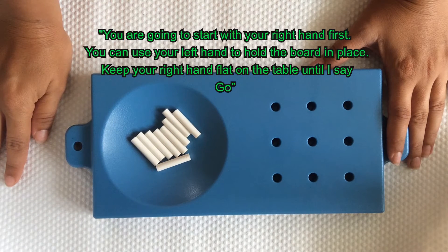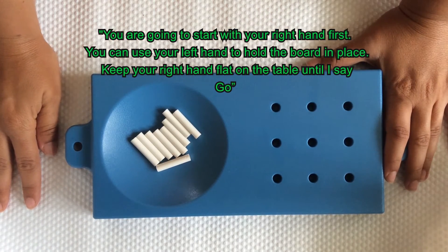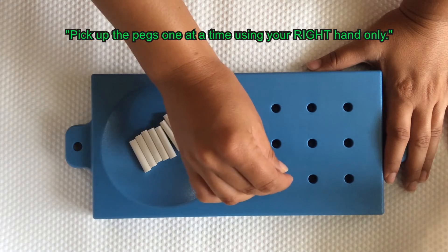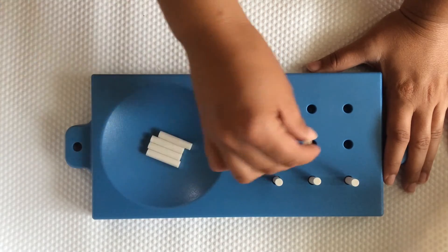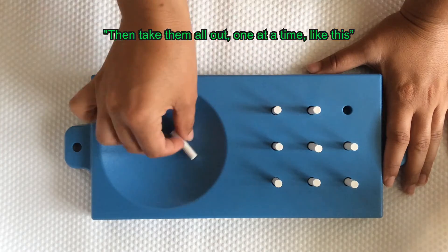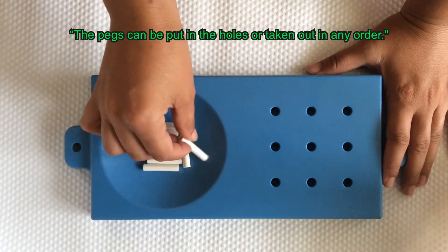I will now show you what to do. I'm going to start with my right hand first. I'll use my left hand to hold the board in place and I'll keep my right hand flat on the table until I say go. Pick up the pegs one at a time using your right hand only. Put them in the holes one at a time until all nine holes are filled. Then take them all out one at a time like this. The pegs can be put in the holes and taken out in any order.